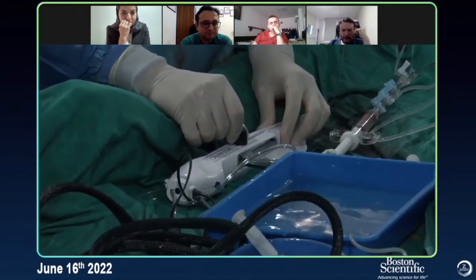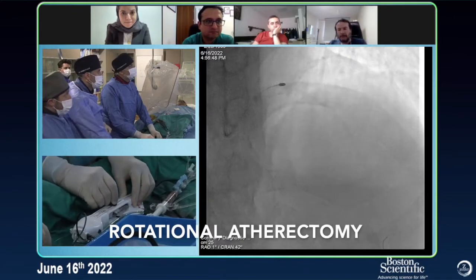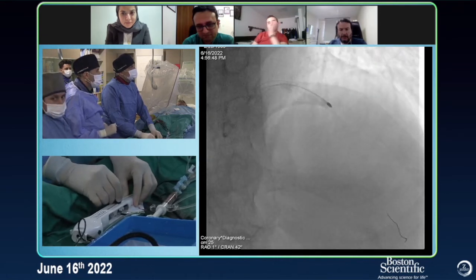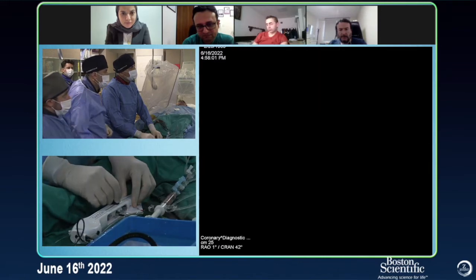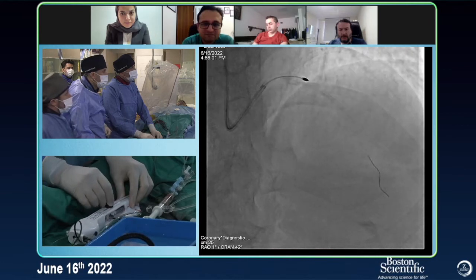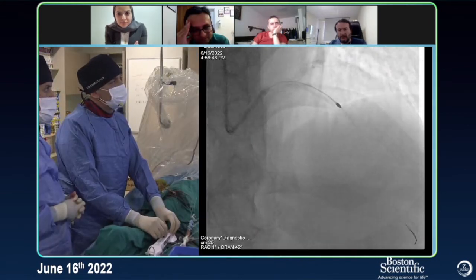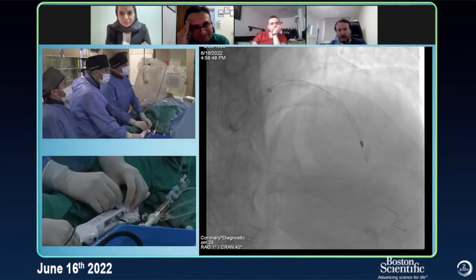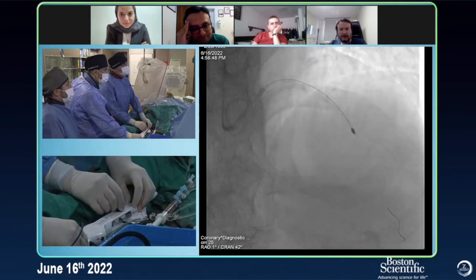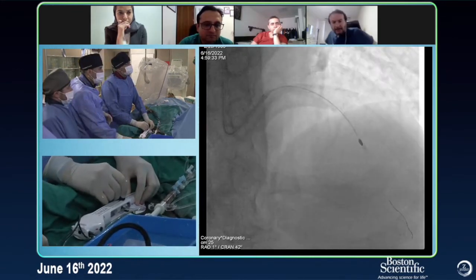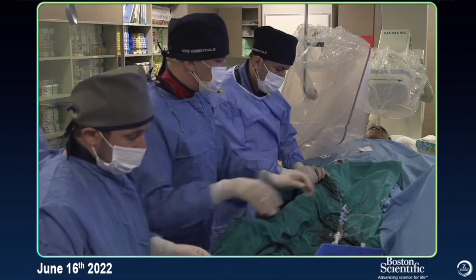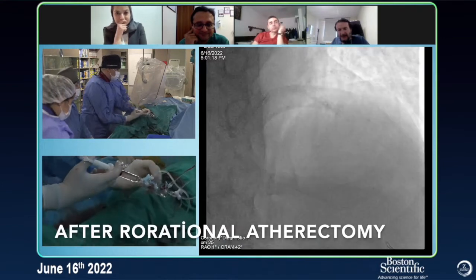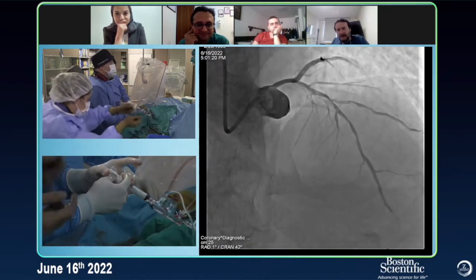Before starting, I'll come back to the end of the rail. We have to push gently. I don't have any resistance so far. I have some resistance here — if there is light resistance, I can push forward. Okay, stop. This is nice — definitely a change from the first run. Let's do one injection to check: if we have anything wrong... everything looks okay, but let's check it again. After dilatation with the balloon, let's proceed.